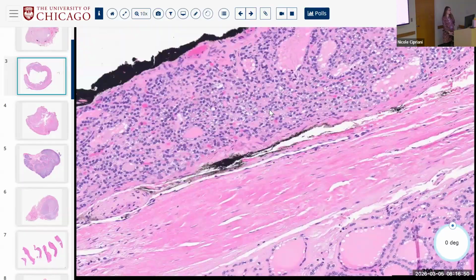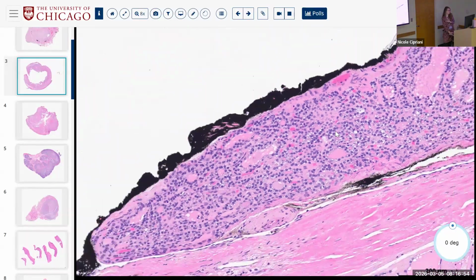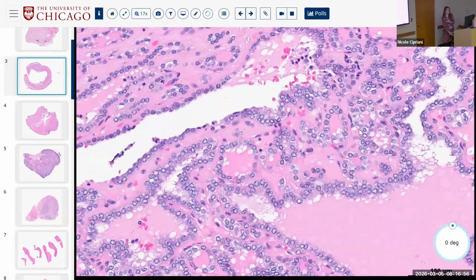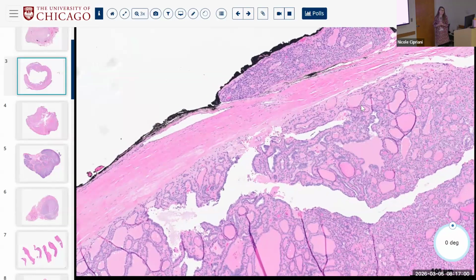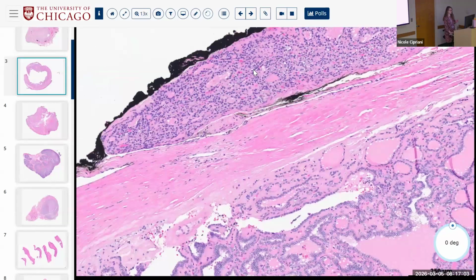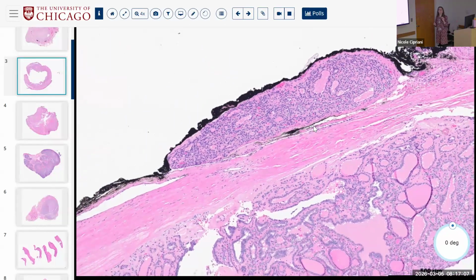Morphology, right? Just simply, does the morphology of this stuff outside look like the morphology of this stuff inside? Not really, right? There's a lot of shaking heads. The nuclei are subtly different. The architecture is subtly more compressed, right? So always evaluate these little satellites with a critical eye, right? And match up the inside to the outside. And in many cases, you'll be able to kind of suggest whether or not they're the same.